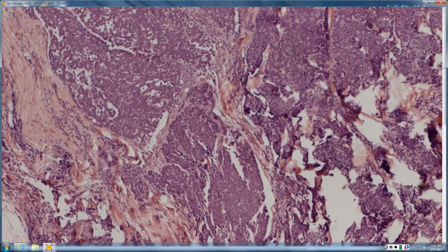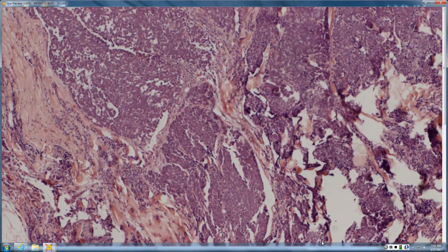And in a small, round blue cell tumor, our hypothesis is that trabecular pattern may be almost as good as immunostains. We're testing that right now. But when present, it certainly leads you towards Merkel cell carcinoma. And the old name for the tumor was trabecular carcinoma because of the growth pattern.